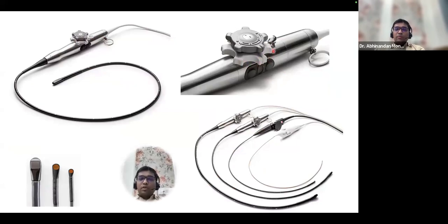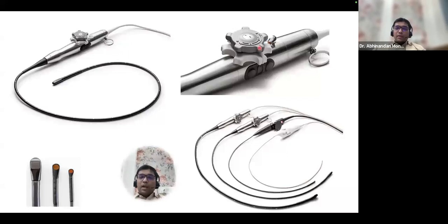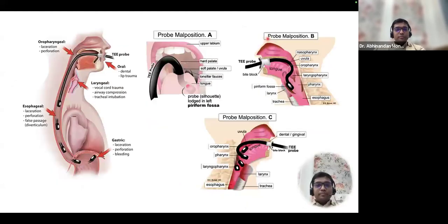Always remember, if you anteflex it, you just make a clockwise rotation, and if you do a counterclockwise movement, it will be a retroflex movement. And in case of the smaller wheel, a clockwise movement will be a right flexion, and a counterclockwise movement will be a left flexion.